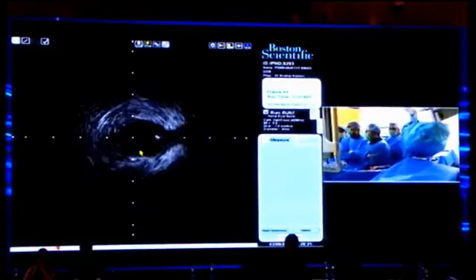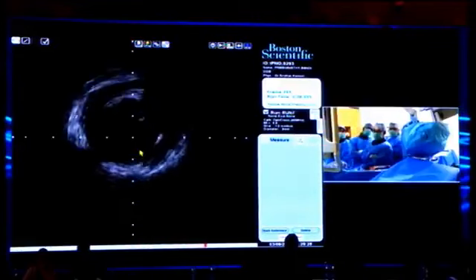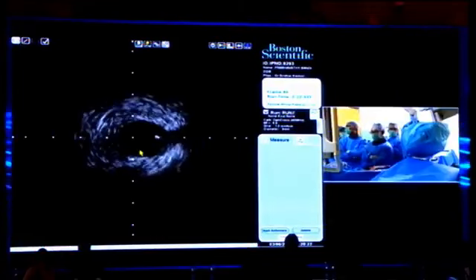Is this the last one? Yeah. Okay. And so I started this IVUS study from the PL, and you can see the second guide wire from the 1 o'clock. Please show me again. Yeah, you can see that around 1 o'clock you have a guide wire.